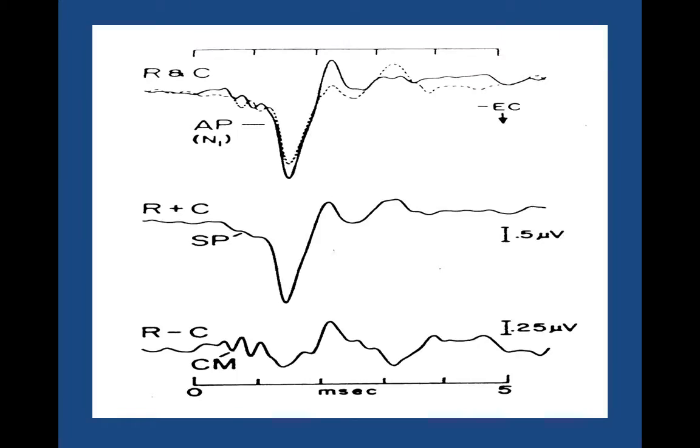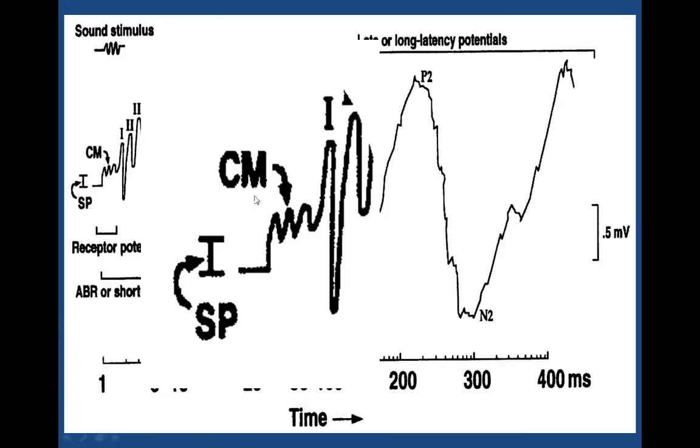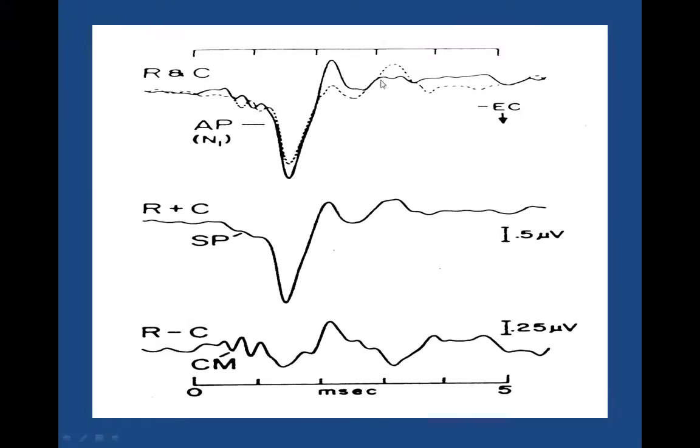This slide here is a really old one that I think L. Coates published in the early 1980s that shows the response, or an electrocochleogram, if you will, to a click stimulus. And some of you might have noticed from the previous slide that there the peaks are going up, here the peaks are going down.